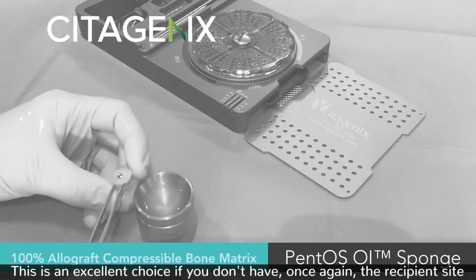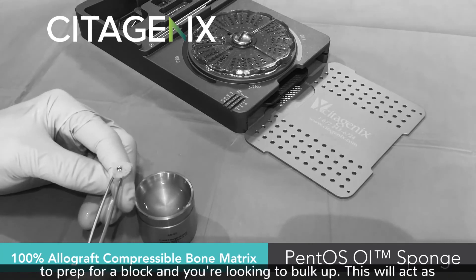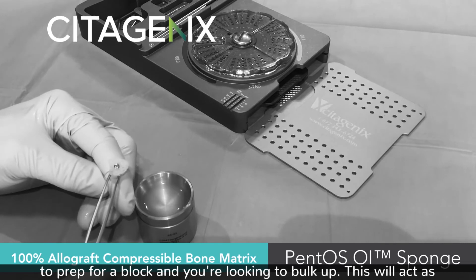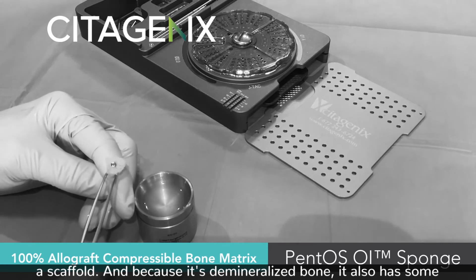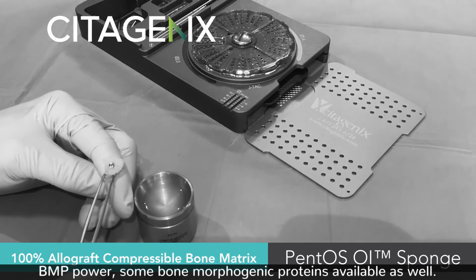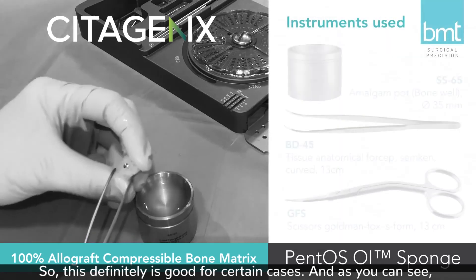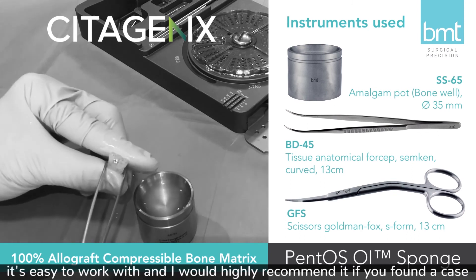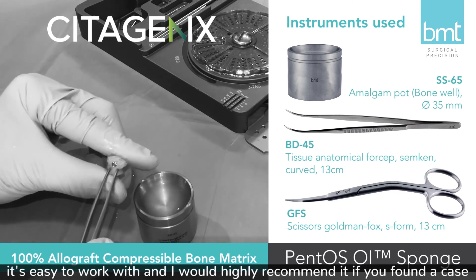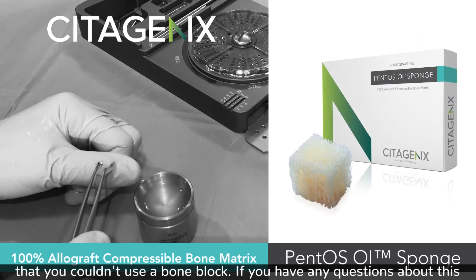This is an excellent choice if you don't have a recipient site to prep for a block and you're looking to bulk up. It will act as a scaffold, and because it's demineralized bone, it also has some BMP power — bone morphogenic proteins — available as well. This is definitely good for certain cases, and as you can see, it's easy to work with. I would highly recommend it if you found a case where you couldn't use a bone block.